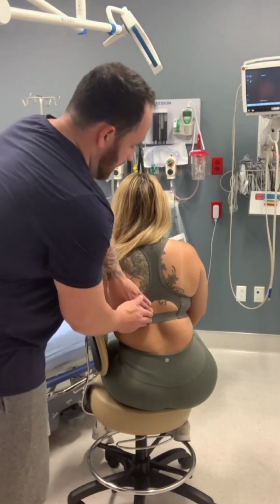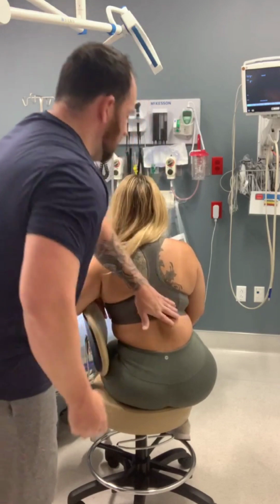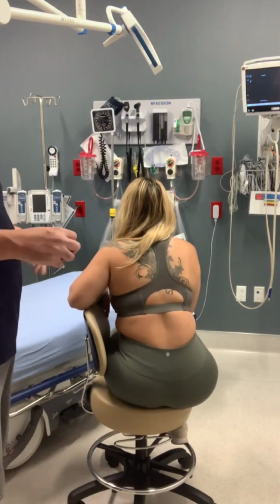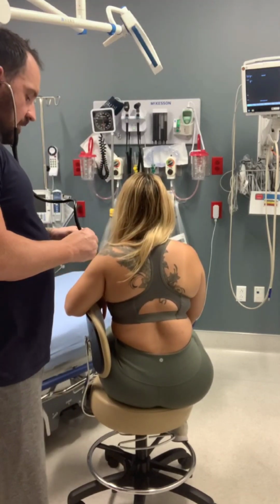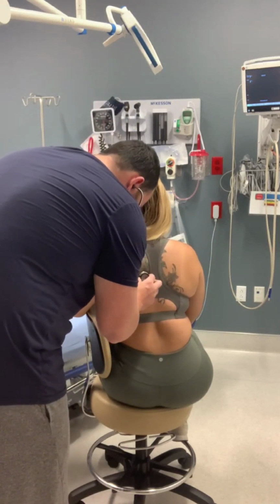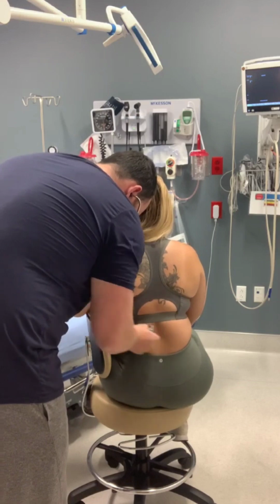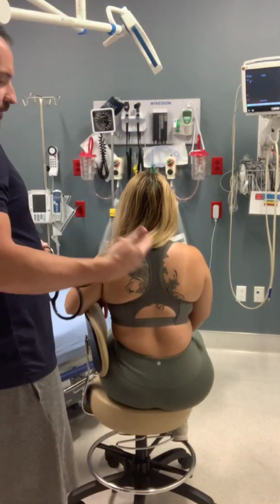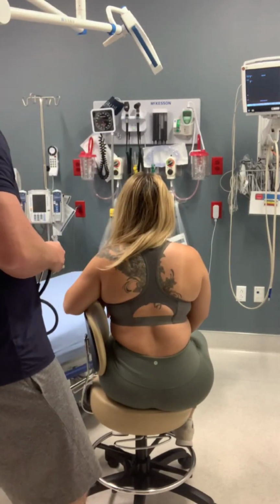Also, do you feel any pain when I do this? No. All right, so no CVA tenderness, no signs of kidney infection. At this point, I'm going to listen with the diaphragm of my stethoscope to the 8 fields. And what I want you to do, Myra, is say E for me. E, E, E, E, E, E, E, E. All right, so basically all I heard was E. I heard no muffled sounds through my stethoscope, which shows no consolidation, which is a normal finding as well.